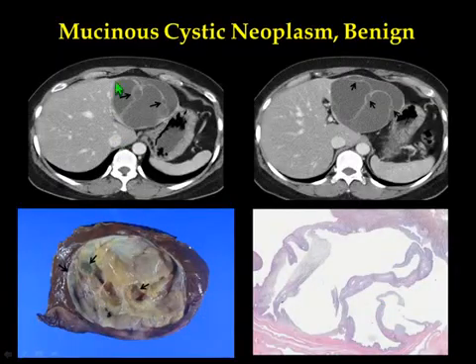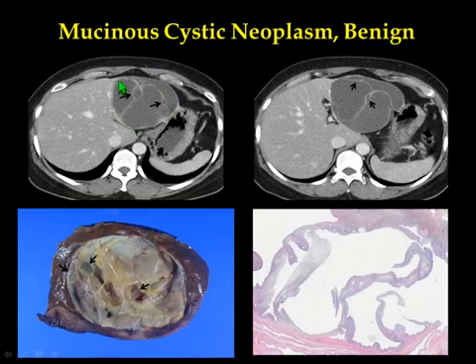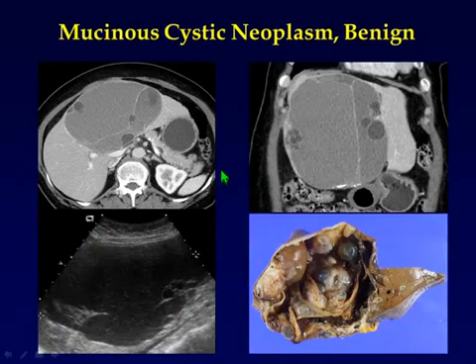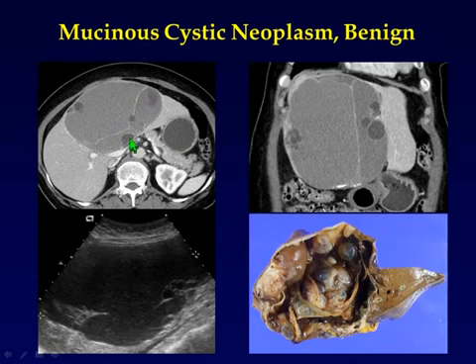Let's have a look. This is a nice view of cystadenoma, which is covered by thick capsules with multiple beautiful septa and daughter cysts appearance. Again, in gross pathology there are cysts within cysts — daughter cysts — and there are multiple thick tumor septa, and also there is ovarian stroma. This is characteristic. Another example shows multiple septa, cystin cysts filled with mucin, and multiple daughter cysts inside.